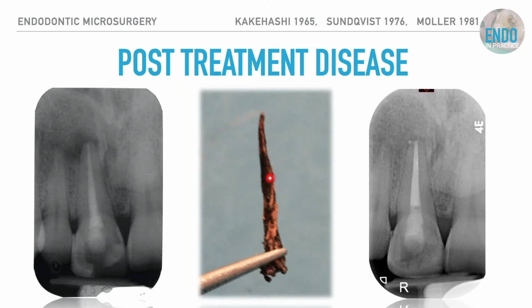The biofilm, you can nearly see the bugs jumping off it. You can see the fur growing on that GP. I think we would all agree that in comparison to the radiograph and actually what we have clinically, that endodontic treatment isn't, or wasn't, ideal. A very well-known clinician once said, it's not what you put in, it's what you take out that matters.